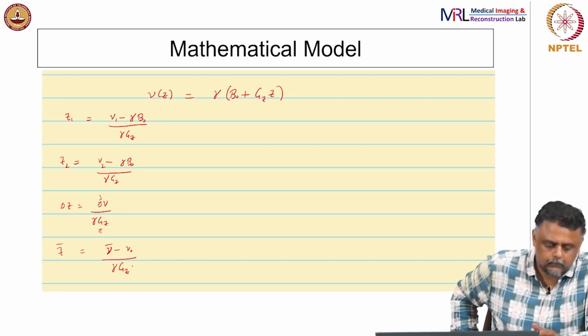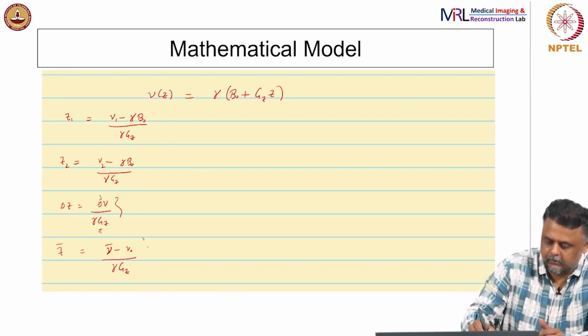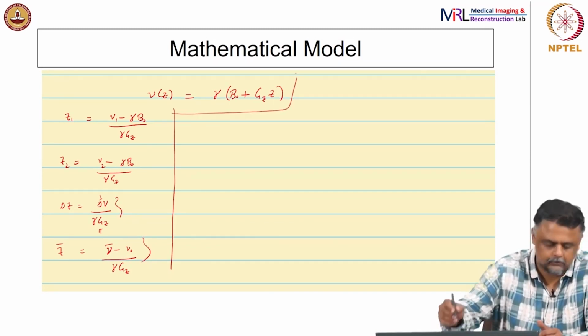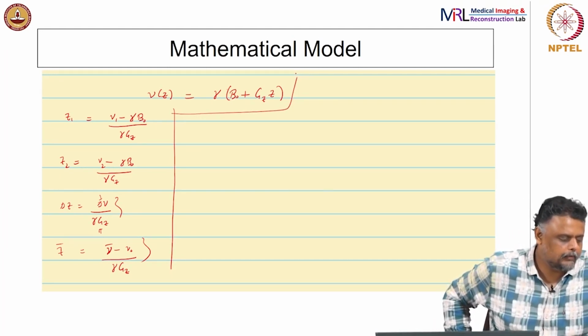Okay. So, this is again the slice position, right. So, all of these are the important expressions. That is one set of equations. Another aspect is the RF waveform. So, what kind of RF waveform do you want?